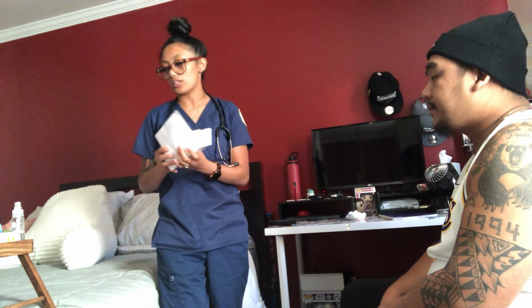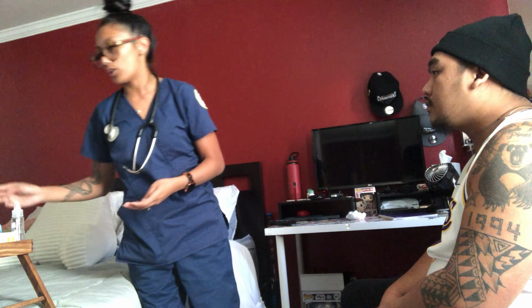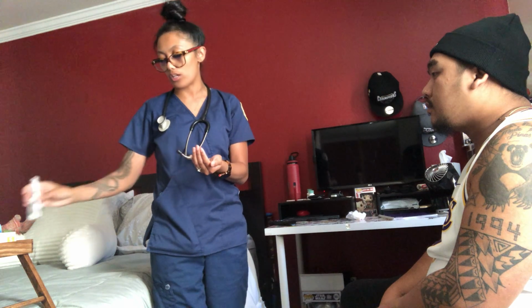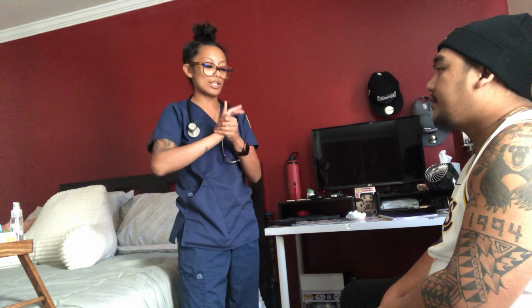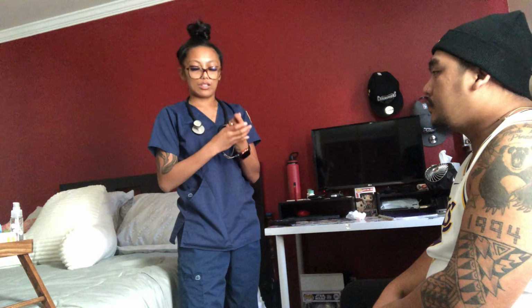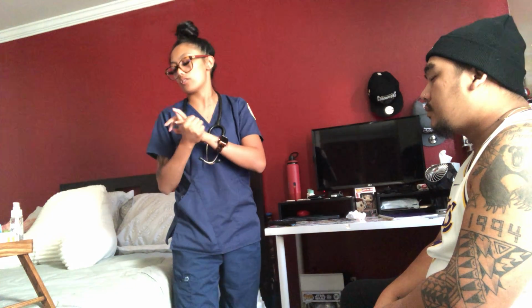Yes. Okay, so since I got the patient's consent, I am now going to check the patient's identification to make sure that it matches my records. Can I get your name and date of birth, please? Charles Sopalasa, January 23rd, 1994. Okay, and can I see your wristband, please? By asking him the date of birth and his name, I am able to check his wristband and the records, and they do match.